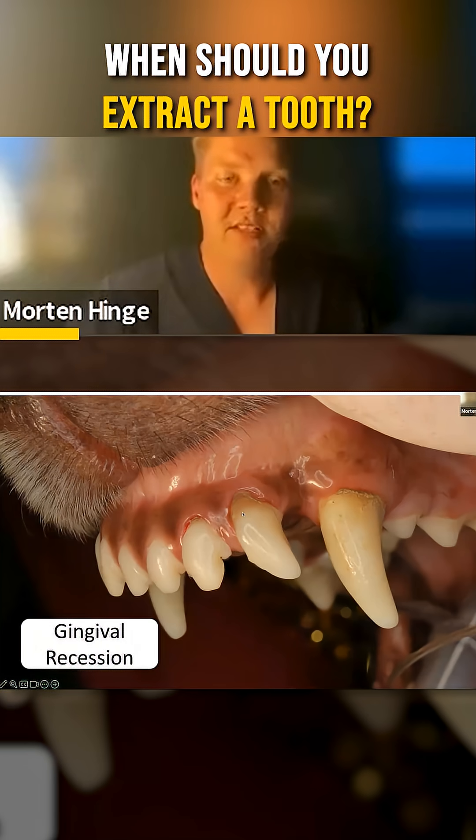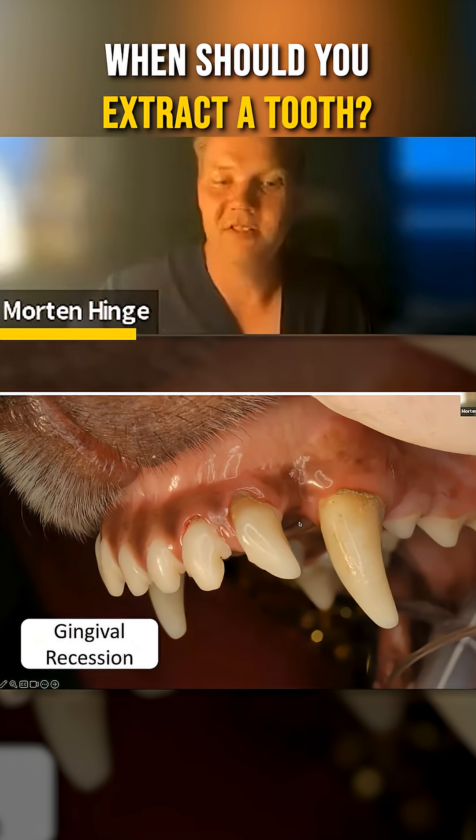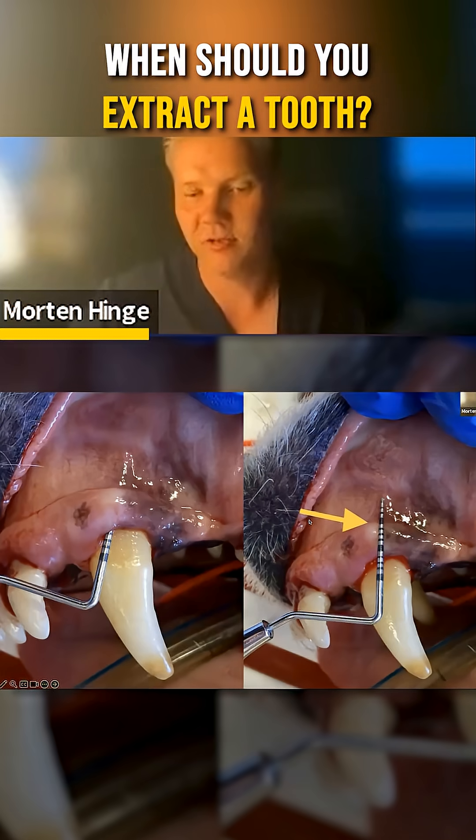This tooth could be saved, but tell the owner there's root exposure, meaning the surface is going to be rough and they need to brush it to save this tooth. If they're not going to brush, this tooth will eventually become so bad you'll need to extract it.